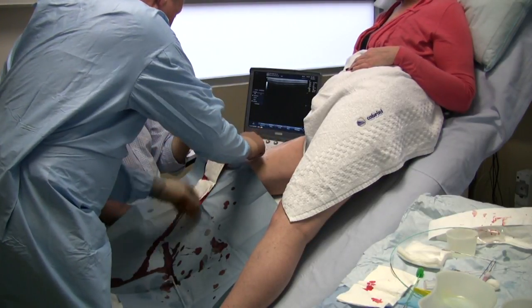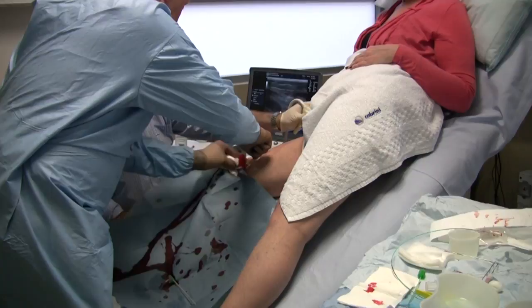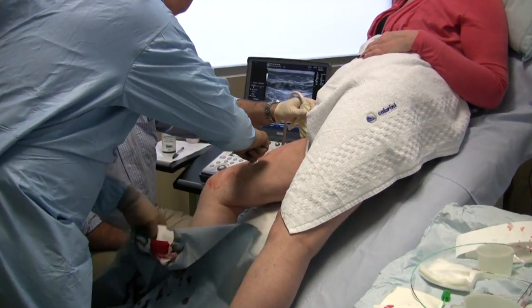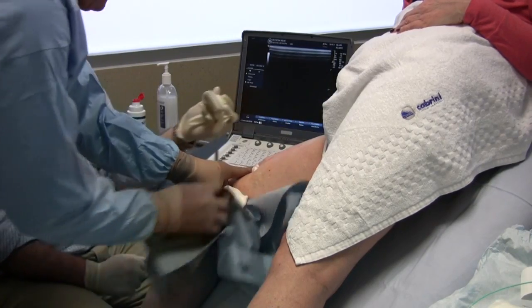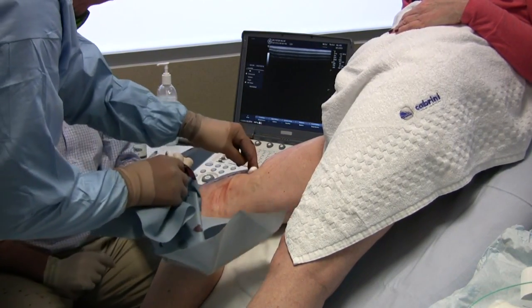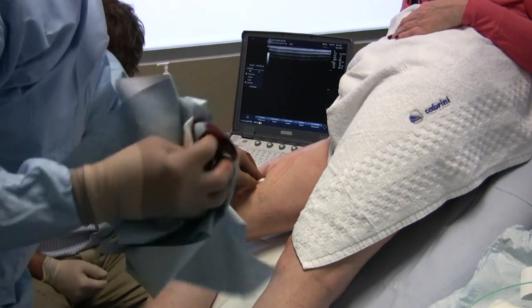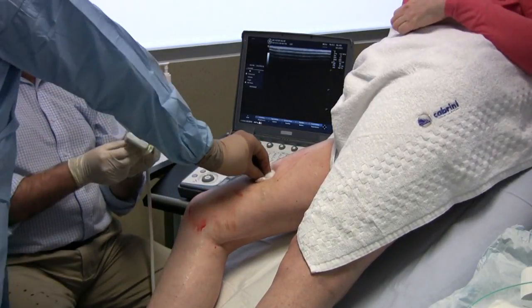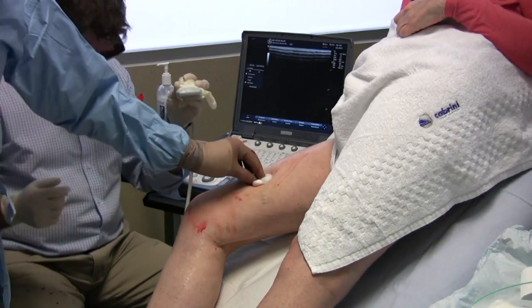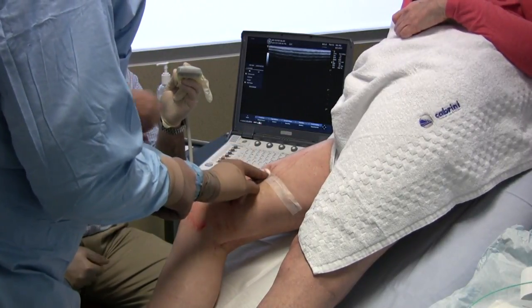Following confirmation of obliteration, the excess sheath is then withdrawn from the vein and the area dressed with tape and a cotton wool button. This completes the laser ablation component of the procedure on the right limb, and attention can then be turned to the opposite limb for the same procedure to be undertaken.